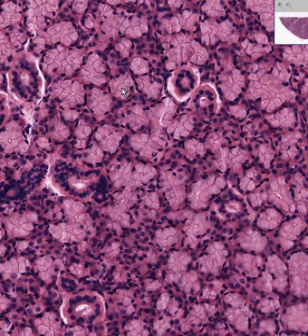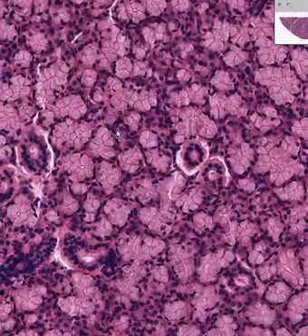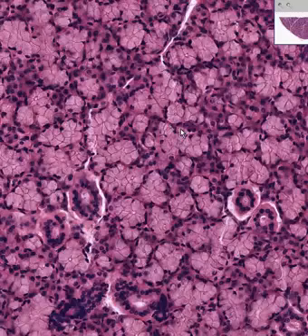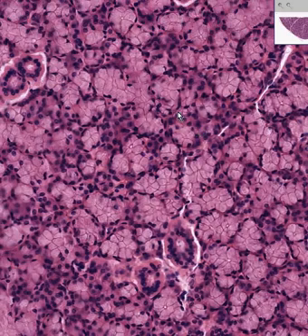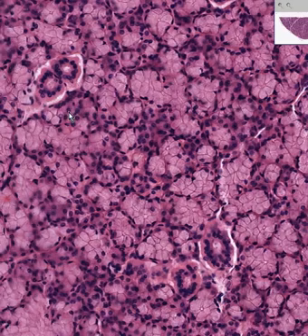In a serous type acinus, and it's going to be hard to find serous acini in a sublingual gland, but in a serous acinus, like perhaps here, the nuclei are not displaced towards the base, and the cytoplasm is more pinkish and more stainable and less watery. So once again, your classical salivary gland, predominantly mucus, which makes it sublingual.